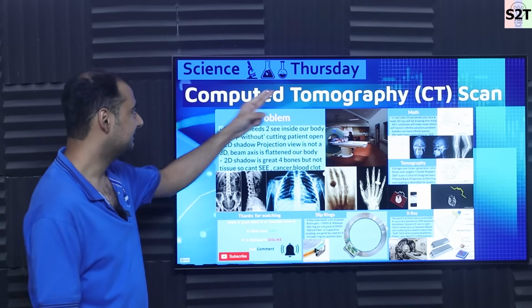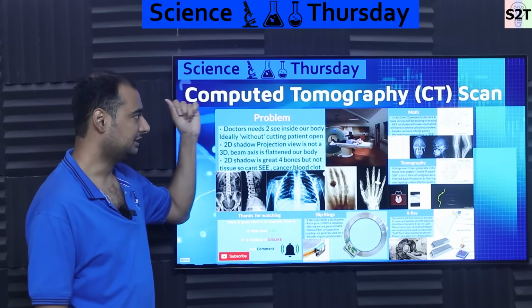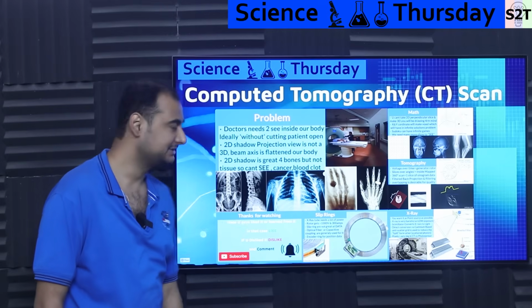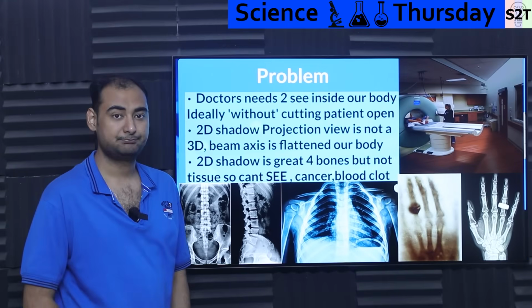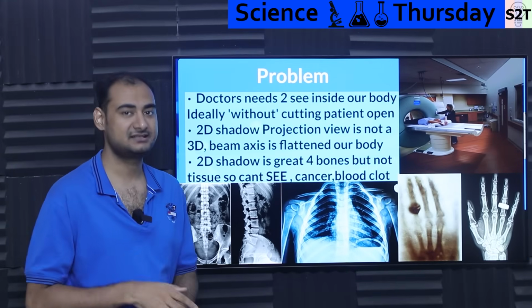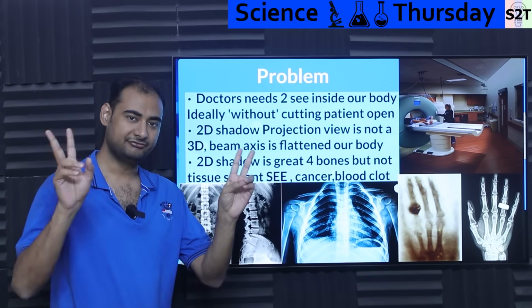In today's show, Science Thursday, we're going to talk about computed tomography scans, or CT scans. So let's dive deep into it. What exactly is the problem that we need to compute something? Well, the problem is that a doctor wants to see inside your body, ideally without cutting you open.